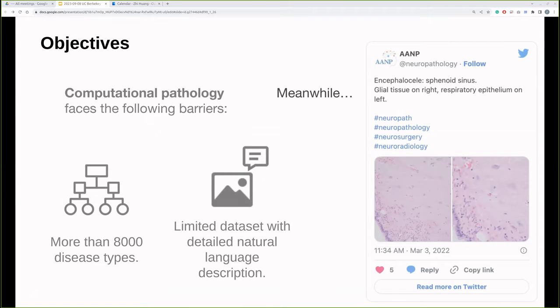thousands of clinicians have been sharing de-identified pathology images with well-annotated text on public forums, such as Twitter and perhaps LinkedIn. So this tremendous amount of data established a really valuable asset for us to train a general purpose medical AI that could assist us in learning, analyzing, and navigating digital slides.